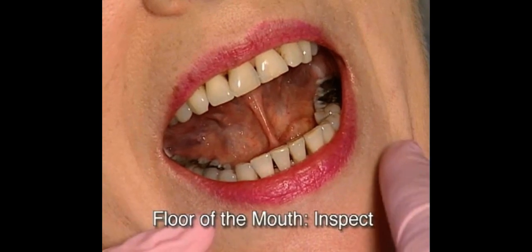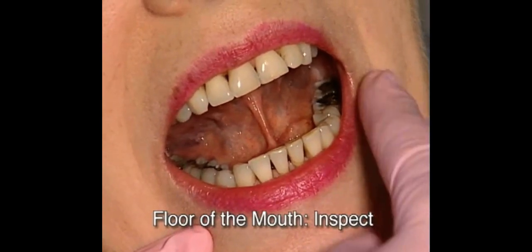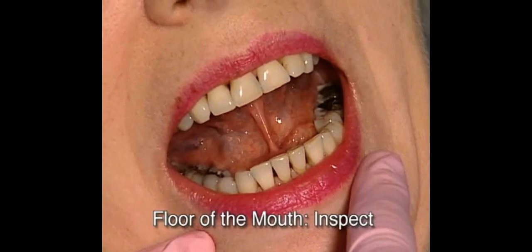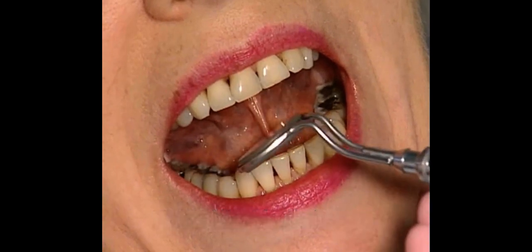Subgroup 4. Floor of the mouth. Begin subgroup 4 by inspecting the anterior region of the floor of the mouth. Ask the patient to touch the tip of her tongue to the roof of her mouth. The inspection will be easier if the patient is in a chin-down position. A mouth mirror may be helpful in providing indirect illumination.